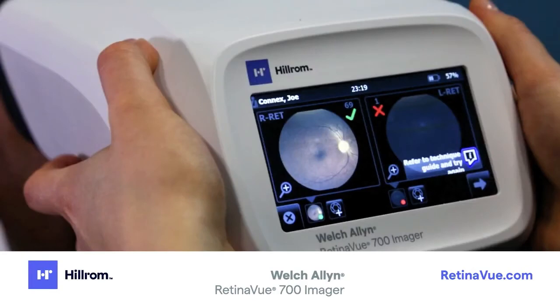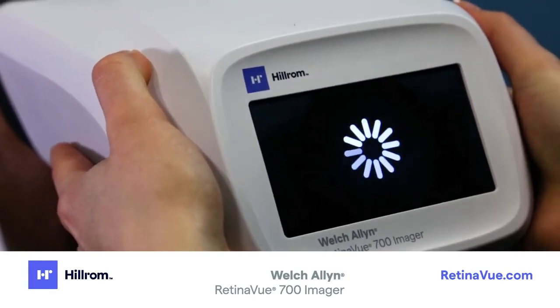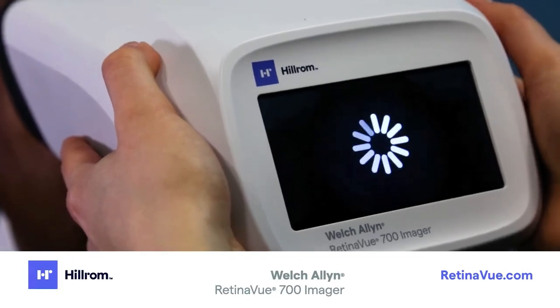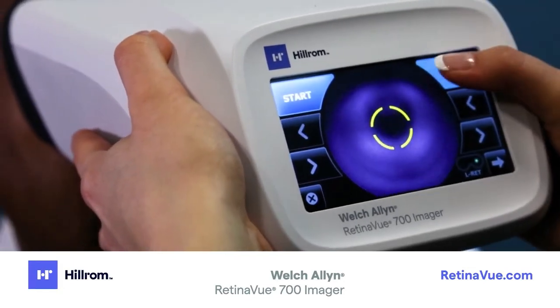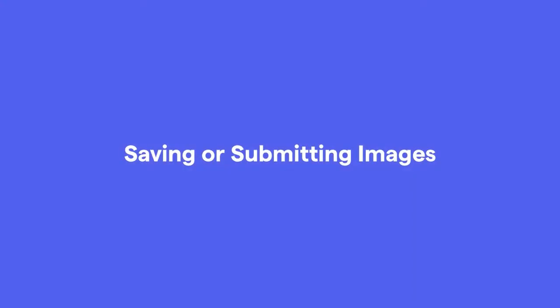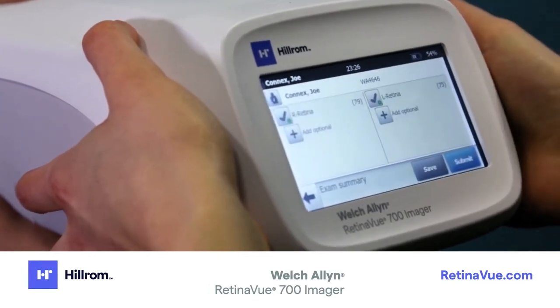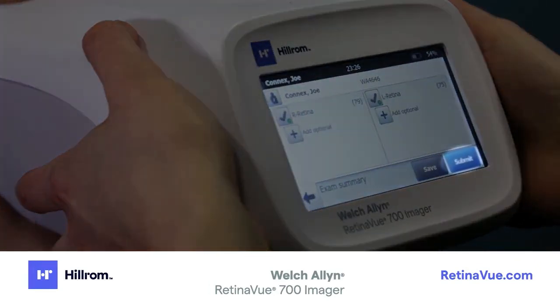It is possible to take a second image by clicking on the plus image icon on the screen — that will bring you to the start screen to repeat the image acquisition sequence. To save or submit the images, proceed to the exam summary screen and select Submit.